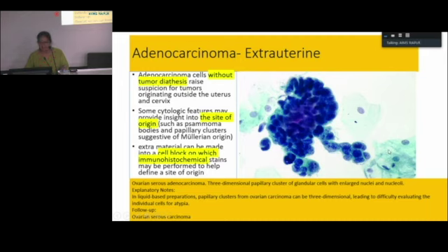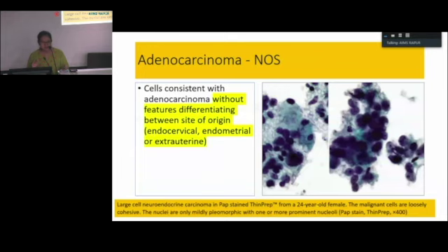For example, this is a papillary cluster. Patient had an ovarian mass. So this was called ovarian serous. Alright. What more can you do? If you've seen this on the smear, take the material, spin it, make a cell block, do IHC for further characterization. IHC can be done on LBC prepared smears as well, but it's not as good as cell block. So cell blocks are preferred.